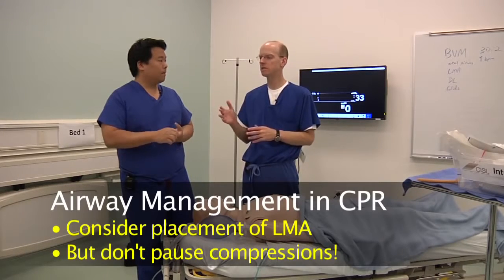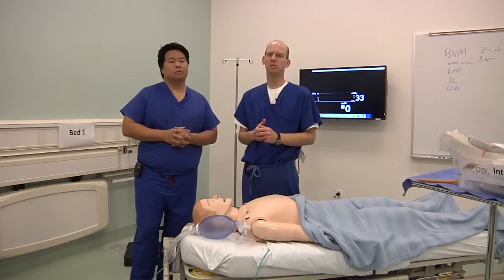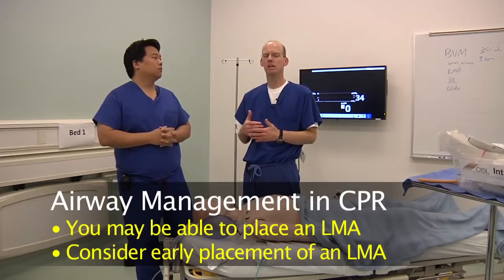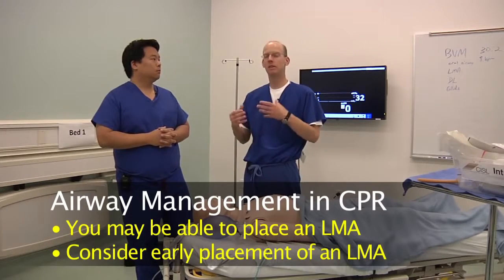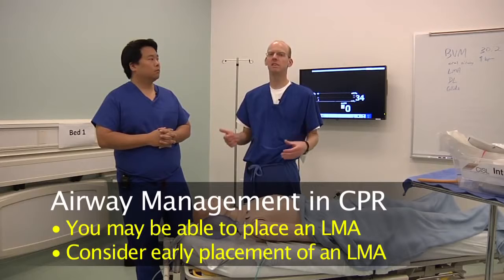And let me just make sure that's clear for our viewers. A laryngeal mask airway is something that you could probably do yourself. It is not that hard to place. It's actually, the data is stronger for a more favorable outcome if you place it early. So I don't want to give the sense that this is the last ditch effort. This is something you might want to move to very quickly because it is considered an advanced airway.